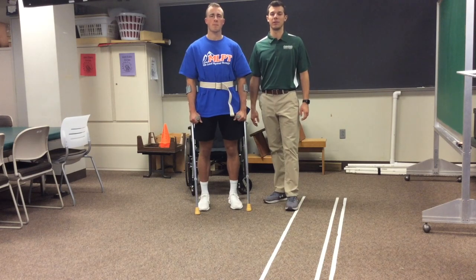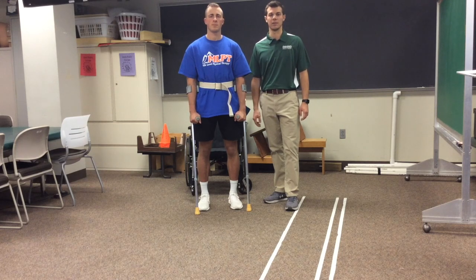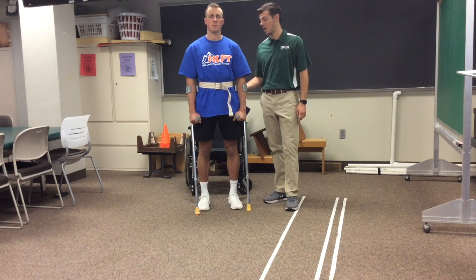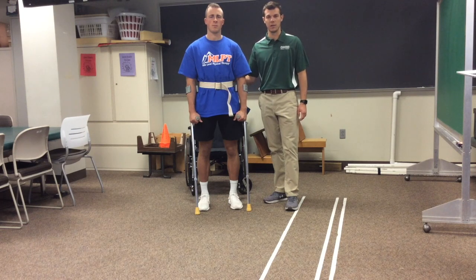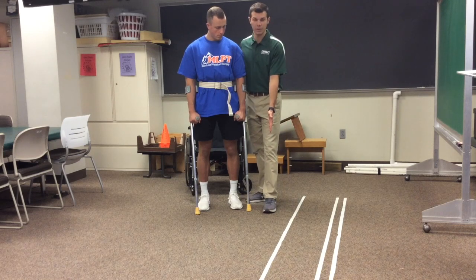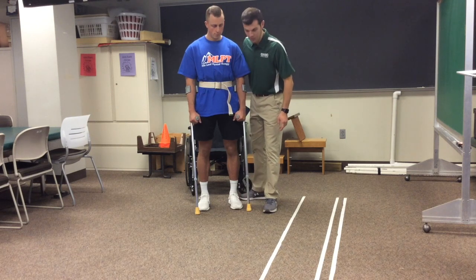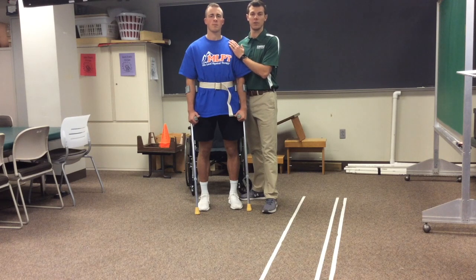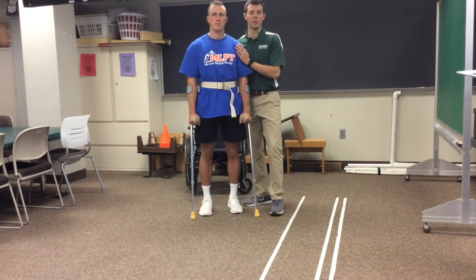For the therapist, remember that you want to stand on the patient's impaired limb. In this instance, Josh's left lower extremity will demonstrate his impaired limb. You want to have a hold of the patient with a supinated grip on the gait belt. Make sure that your feet are in an L position with your forward foot facing the direction of movement, your foot slightly behind the patient. You can also put one hand on the shoulder just as extra protection. Now we're in proper position.